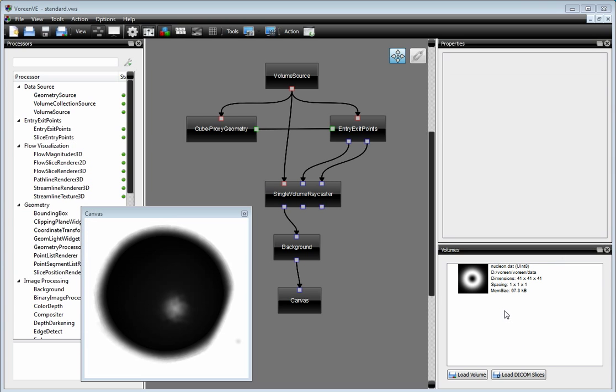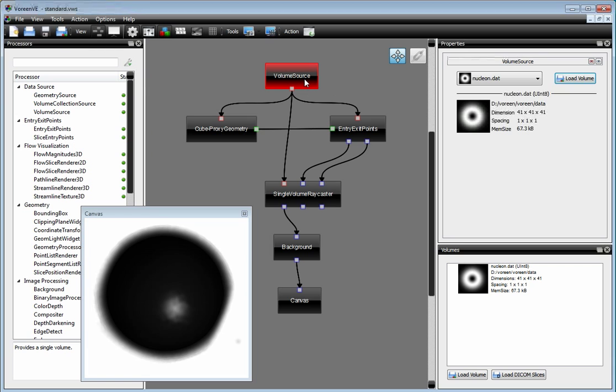There are three different ways of getting data into the volume container. First of all, you can use the Load Volume icon up here, or you can use the Load Volume functionality here, or directly in the volume container.